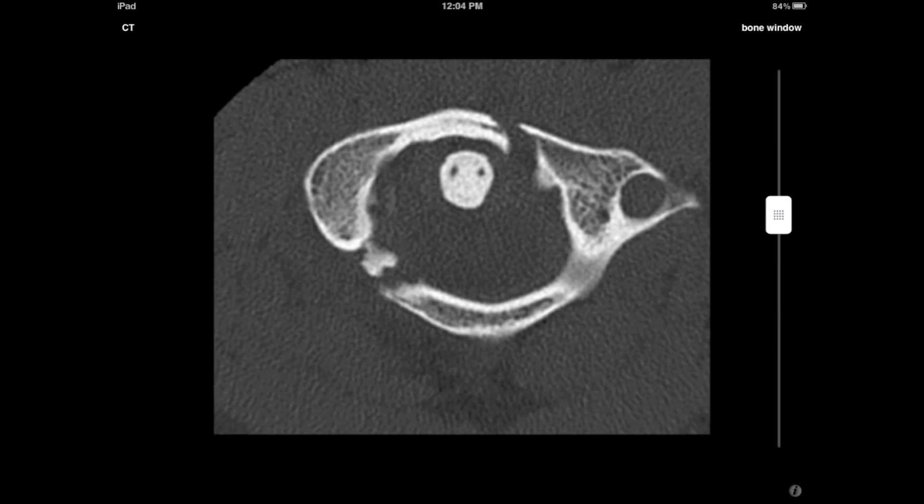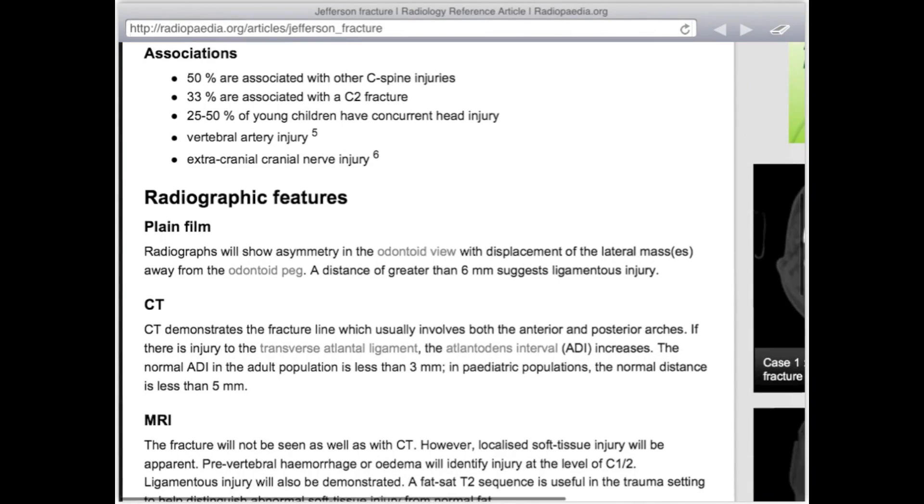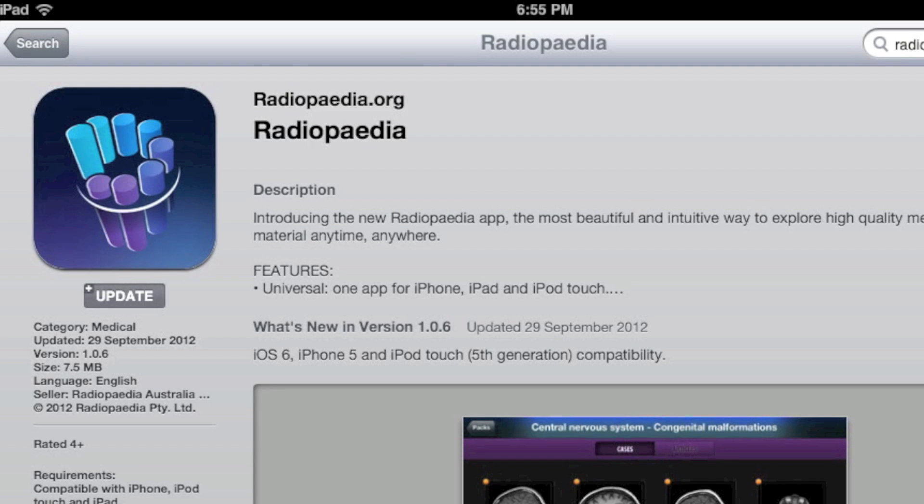So there you have it — the Jefferson's fracture of C1. You can find out more on our Radiopaedia website where there are several other case examples, and this case is featured in our Radiopaedia iPad app which can be found in the App Store.